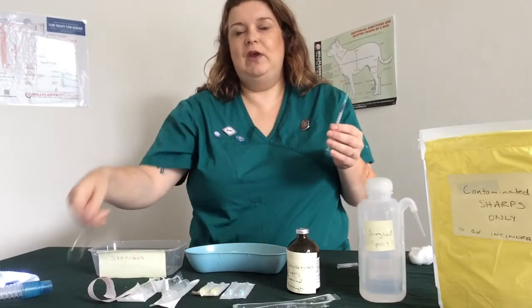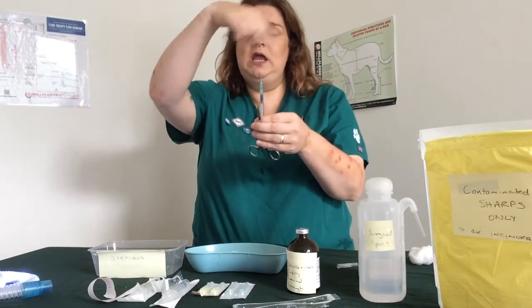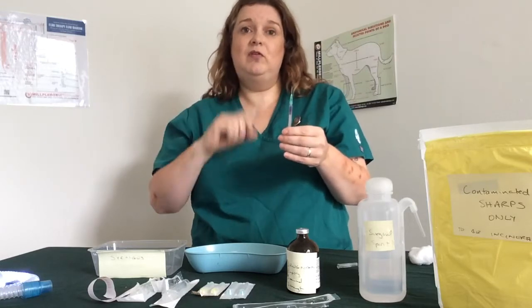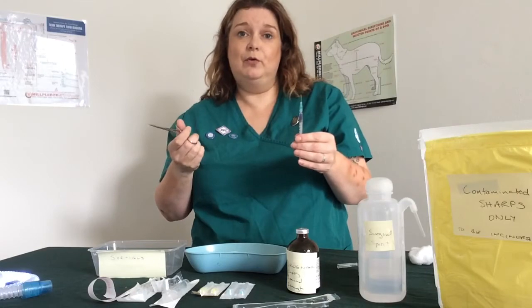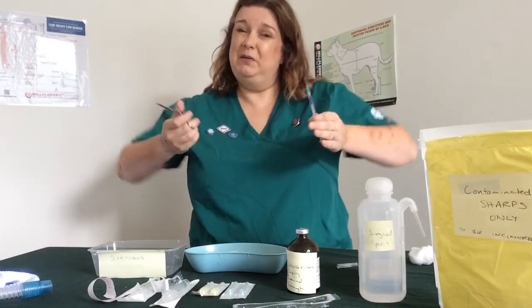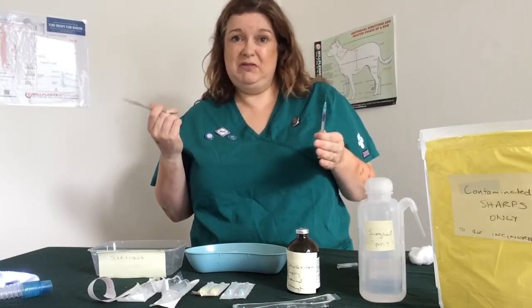And then, safe ways of getting rid of a needle: you do not go back with your bare hand to a naked needle. You cannot do that. You can handle the needle when it's got its safety cap on with hands, that's fine. This, you've got a couple of different options. Some people do actually put it in the sharps bin. I find that a bit, frankly, gross because you've got lots of dried blood and old medicines in there.